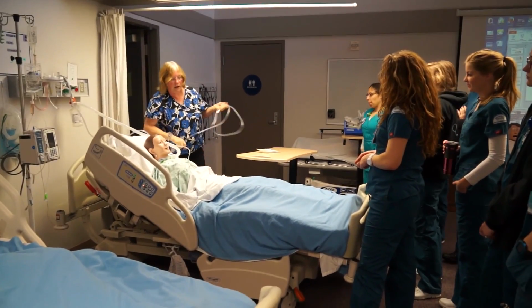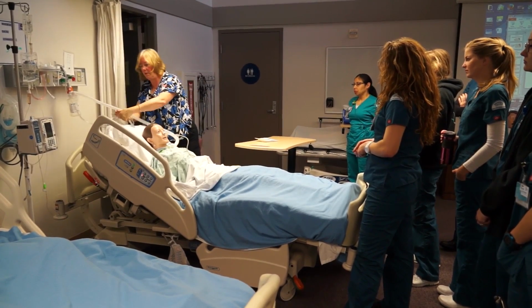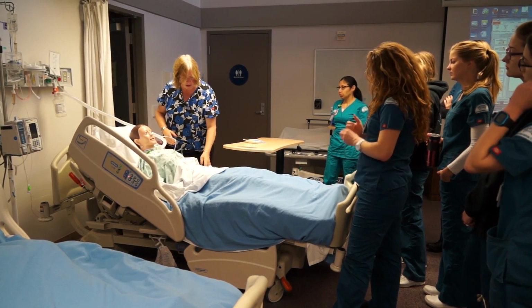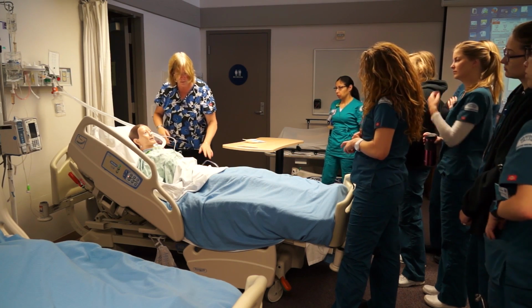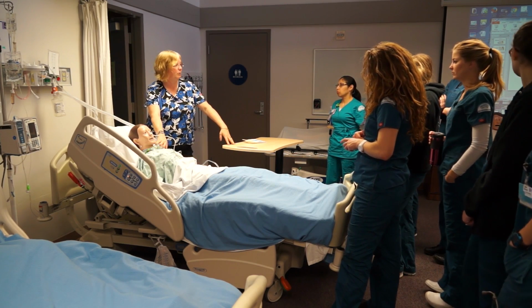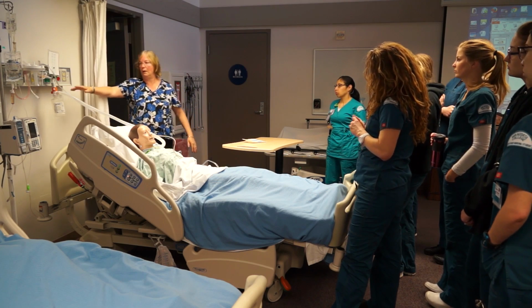Okay, so I have a fairly awake, alert patient here who's able to call me and tell me he's having respiratory distress, or I walk by his room and hear his O2 sat alarm going off, or I hear him kind of gurgling. My patient right now in this setup is strictly breathing on his own. All he's doing is getting supplemental oxygen from the wall here.